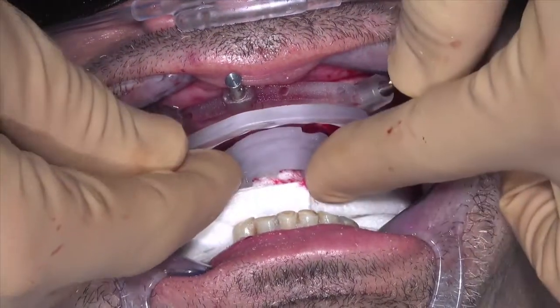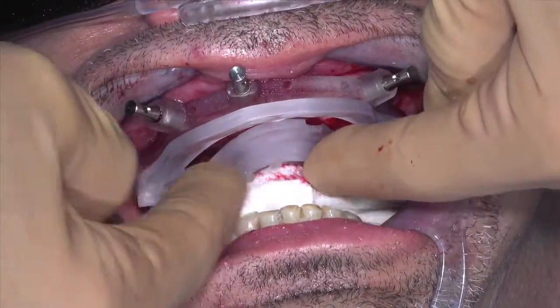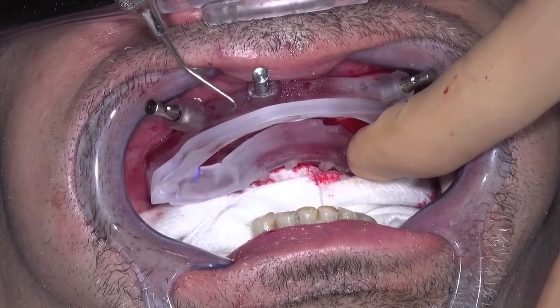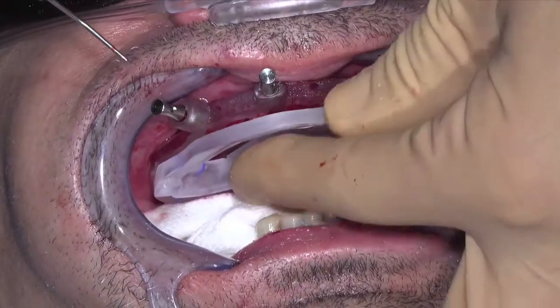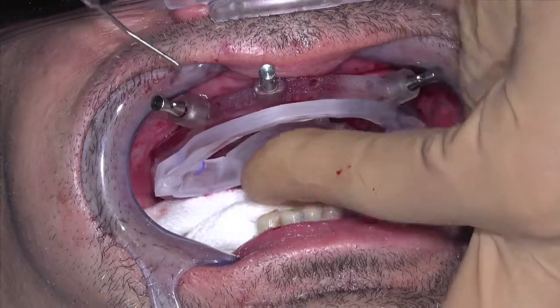As an option, if an angled rotation guide has been fabricated, the clinician can quickly seat this and evaluate if it rocks or has any gaps. It is important to verify that the palatal keys are seating completely into the palatal slots of the bone foundation guide. Reducing any high spots will help to ensure a complete seating of the surgical guide and the other prosthetic guides.